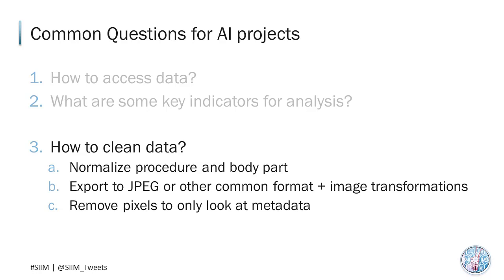Then you may want to extract the pixel data out of the JPEG and then perform some image transformation or feature extraction using your favorite algorithm. Note that DICOM supports multiple image formats, so you have to take that into account. Furthermore, you'll want to extract the reference metadata from the DICOM header for your analysis. And then I can run my favorite algorithm.